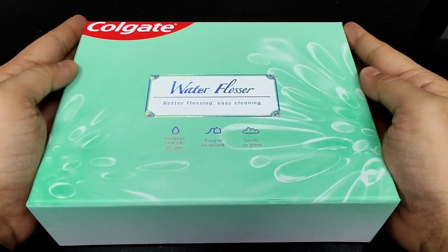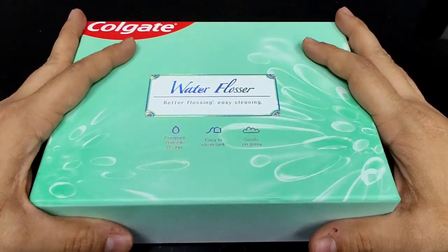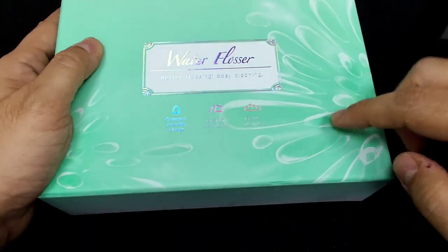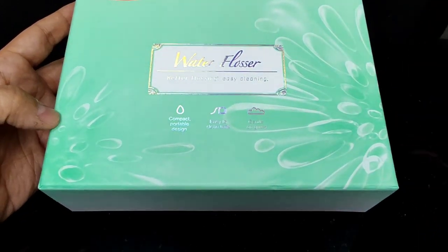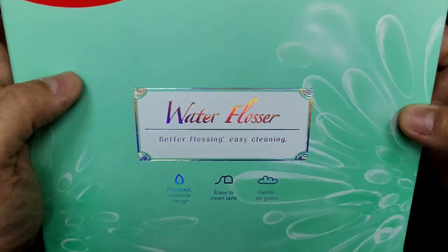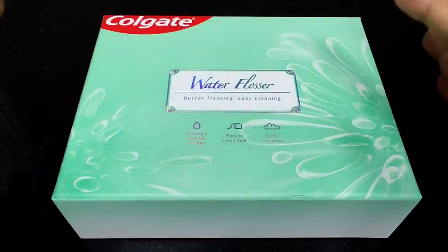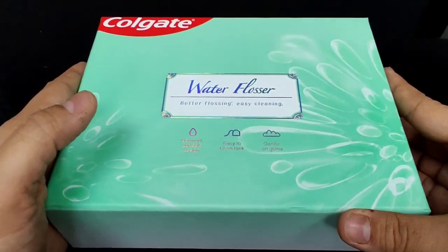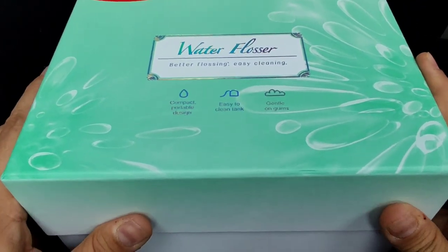Let's unbox. The first thing about the box that brought a smile to my face was the very color — it's an aqua color that goes with the theme of the water flosser. I really loved the water droplets design, beautifully shaped to create a flower, and there's a shimmering hologram that all comes together to create a very beautiful vibe around the box of the Colgate water flosser. The design team has done a swell job with it.